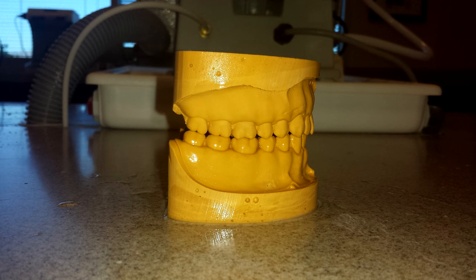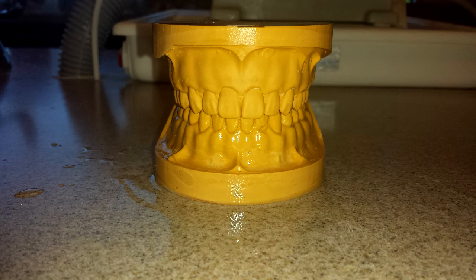Here's our final piece. Our two casts should be parallel or relatively parallel. It looks like on the upper cast there's a little bit of an angulation — probably trimmed a little too much in the anterior. They should be parallel with the occlusal plane, and the bases of the cast should be relatively parallel as well.